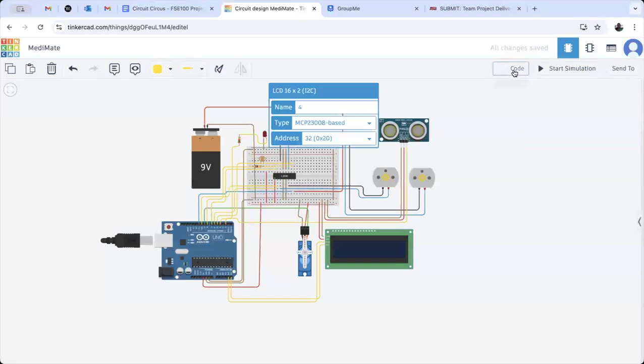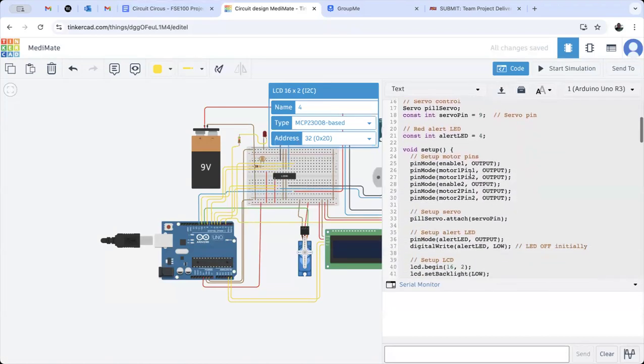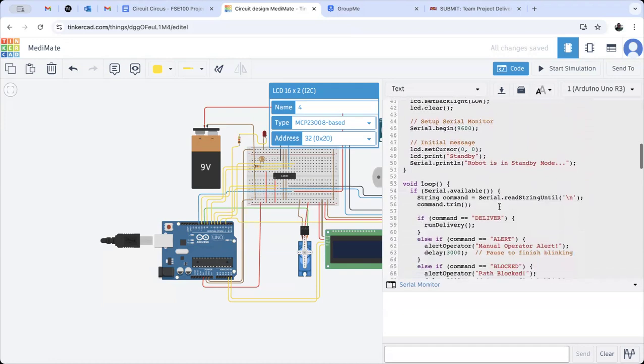And so let's just take a look at the code right here. We included three different libraries. This liquid crystal one was a little bit of a doozy because I kept on selecting the wrong one. And then we have a lot of constants right here. We go over to the setup. So we want to set up the motors, because the motors will turn off once it gets closer to the patient. And then we also have the microservo, which will dispense the medication. The LED is off initially and will only come on when an alert happens. And we just go down.